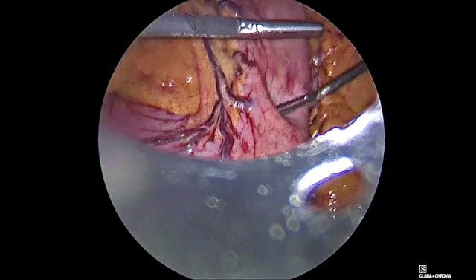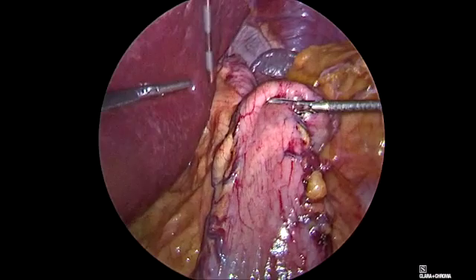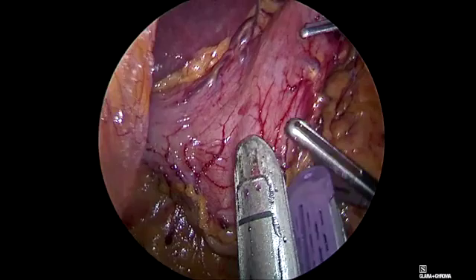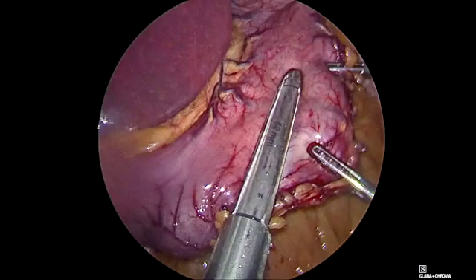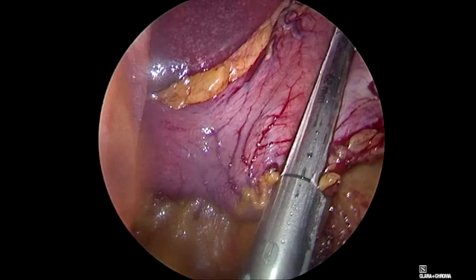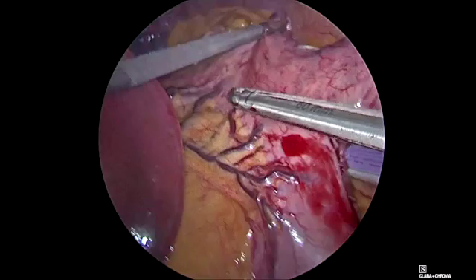We are now asking our anesthesiologist to insert the bougie tube — it is a 32 French bougie tube. Some might think this is a very small bougie tube, but we do not like to go too tight around it. We are inserting the stapler through the 12mm port at the umbilicus. We have to take care with this first stapling line because we want to keep enough entry and we do not want to create a narrow point exactly here. So it is important to be a little bit far from the bougie tube on this first line of stapling.